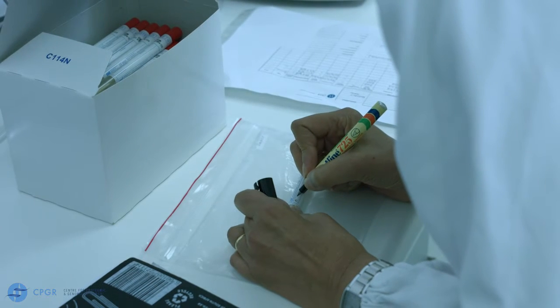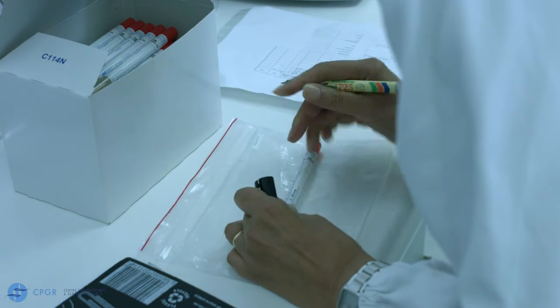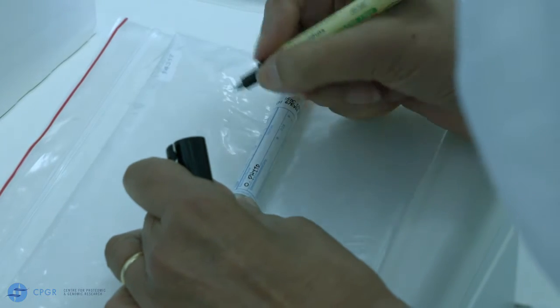As with all samples to be collected from patients, label each buccal collection tube with patient's details.